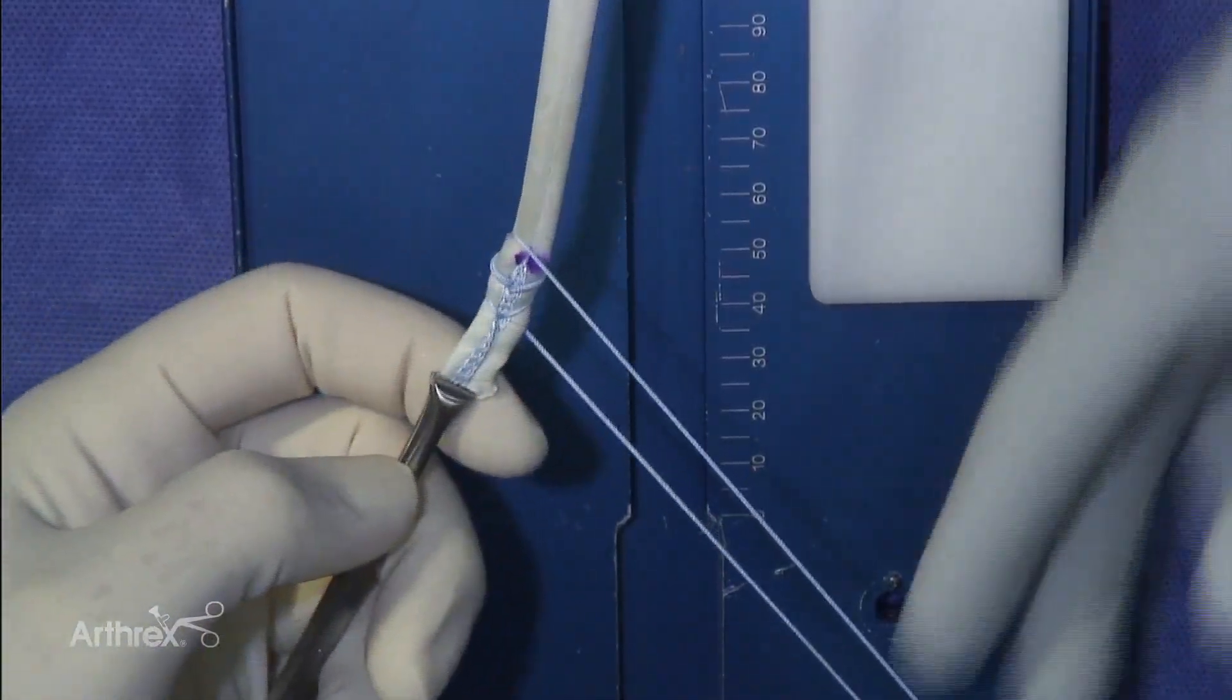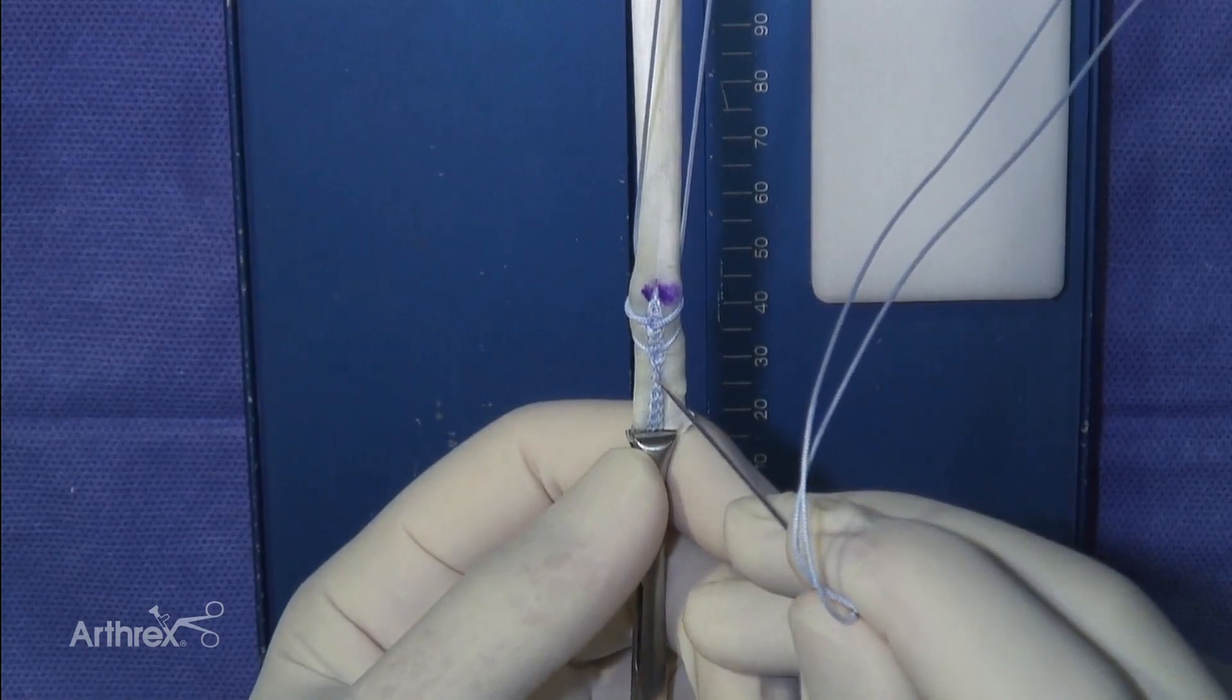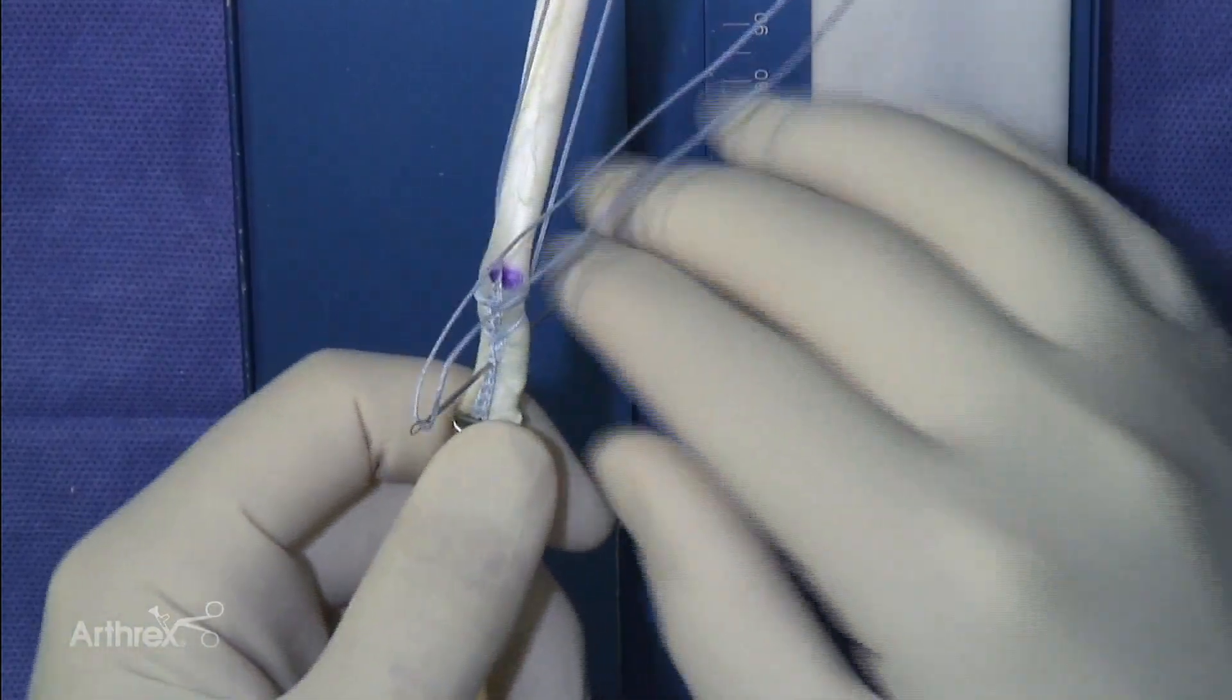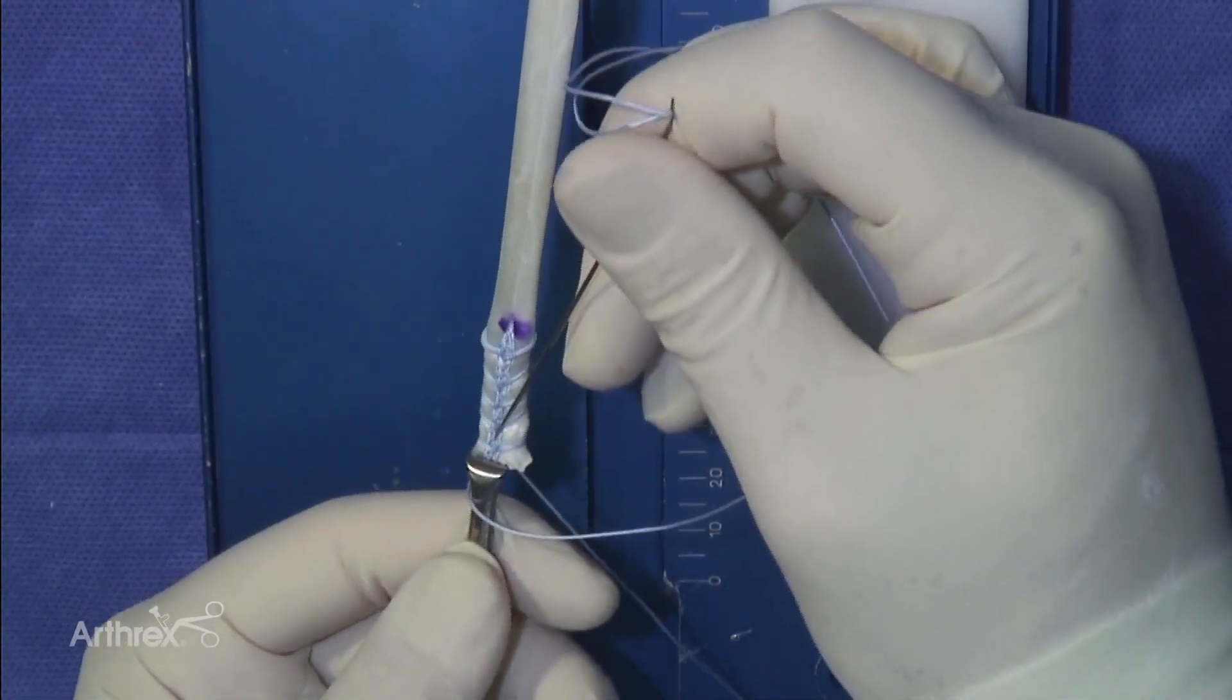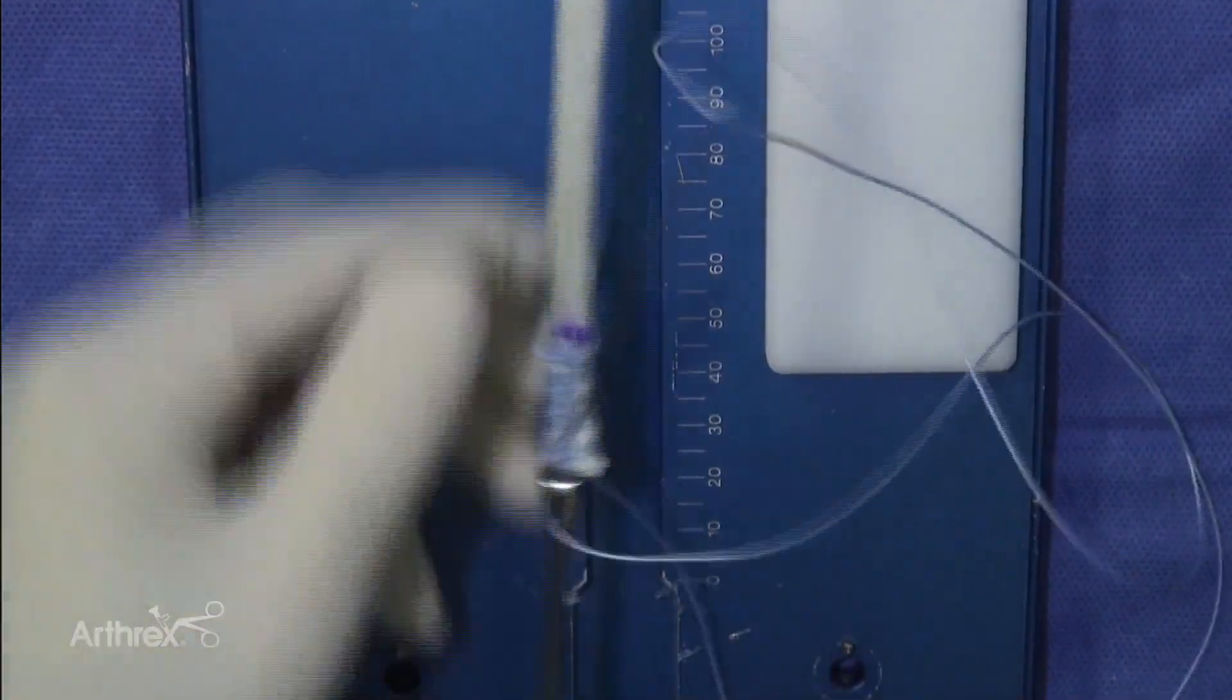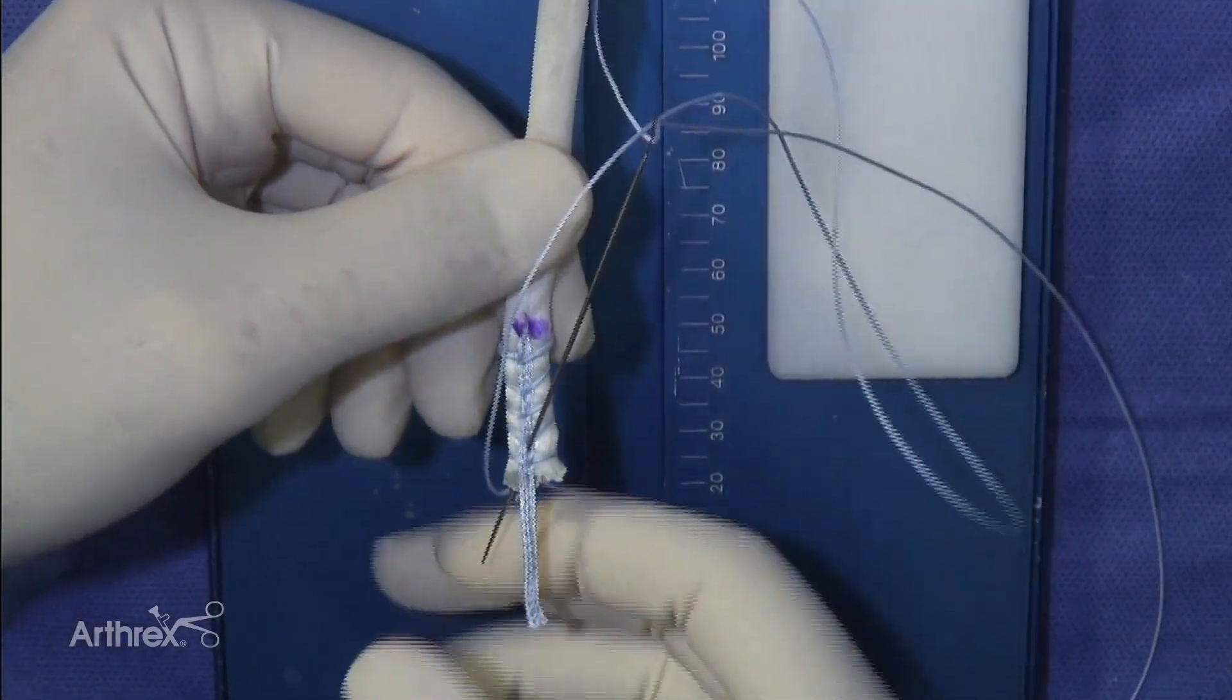Continue the stitching pattern to the end of the graft. For the last pass, place the needle proximally to the previous stitch in order to create a locking stitch. Direct the needle out the end of the graft.